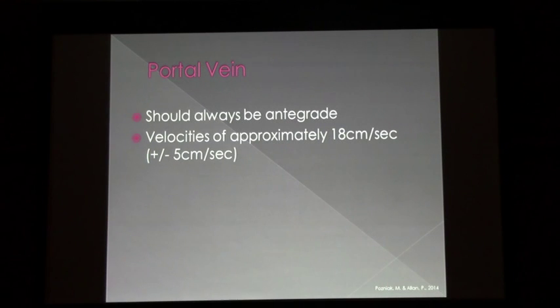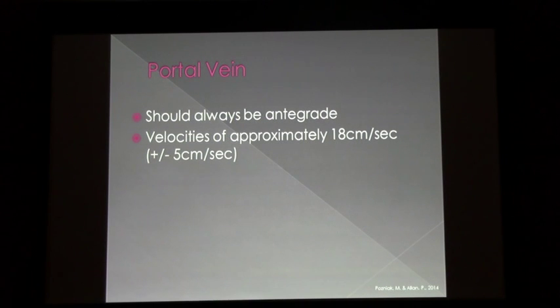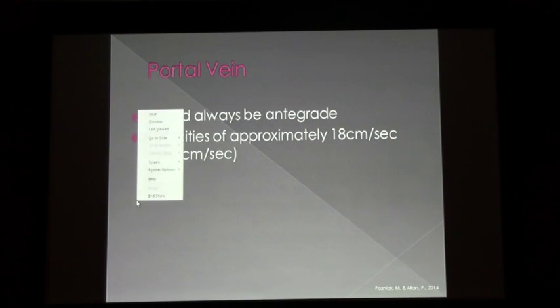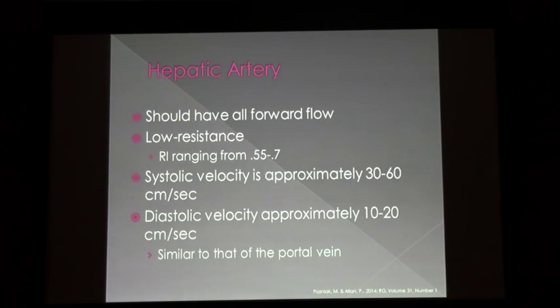I want to ask one question about that. More recently, younger people, hepatic artery, having systolic way above 60, like 120. The problem with doing hepatic arterial circulation is diet can influence that. You have to be really persnickety about doing all that kind of stuff. What we're going to be looking for there is the pulsatility index or the RI, which is often more important in these. So you want to be thinking about what the resistive indices are in this situation, and what else are we seeing?